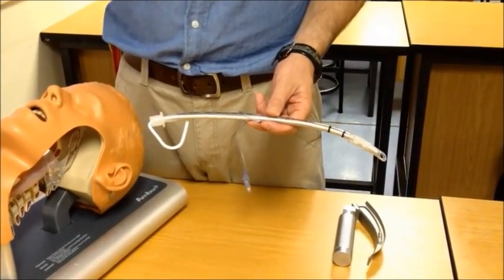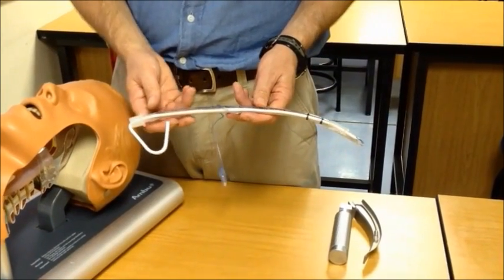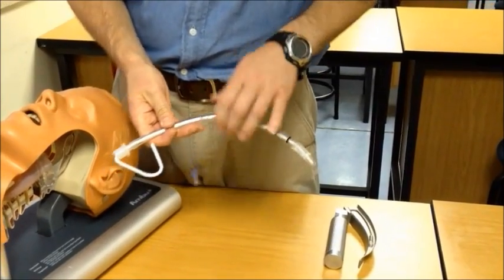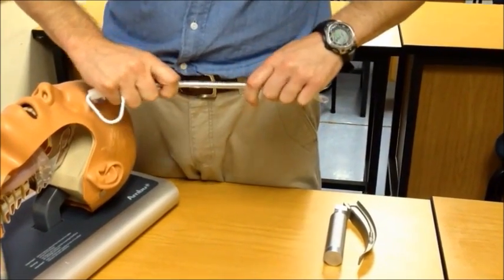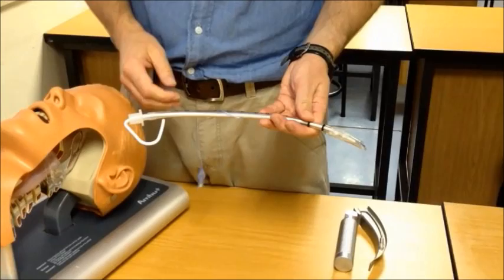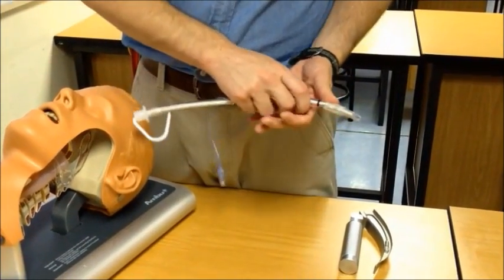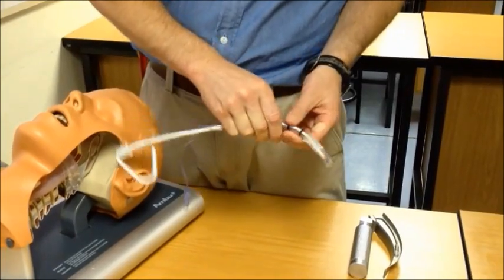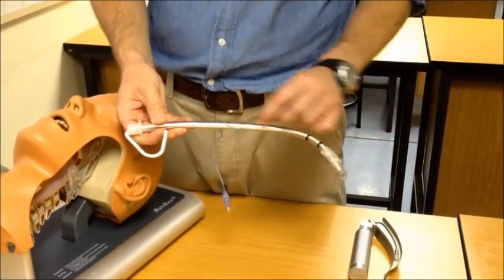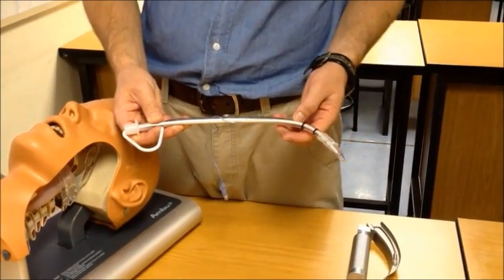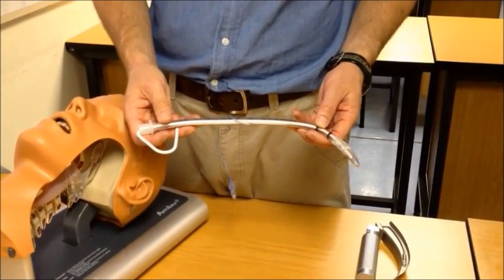Once the stylet has been introduced into the ET tube, there are many different ways that you could mould it. The classic way is a simple curve. Many clinicians now prefer what is called the hockey stick configuration, where the ET tube is bent like a hockey stick close to the end and kept relatively straight. How close you bend it to the edge of the tube is up to personal preference and the size of the patient.